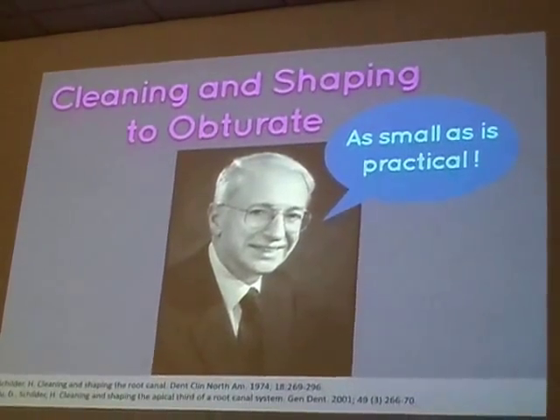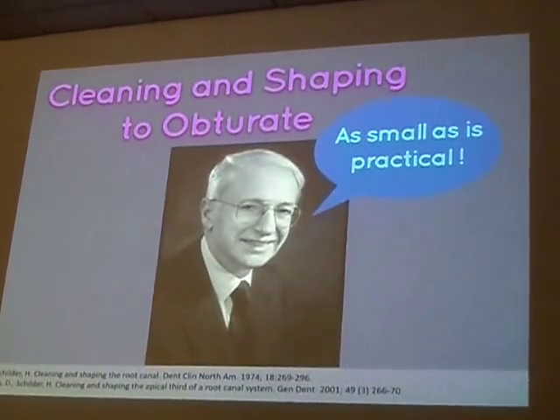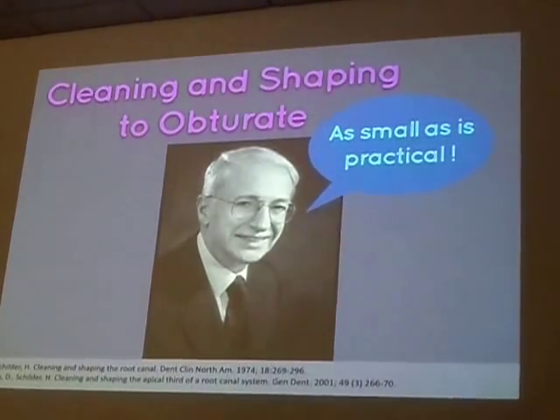So, looking at obturating the tooth, Schilder traditionally said that we should instrument to as small as practical.